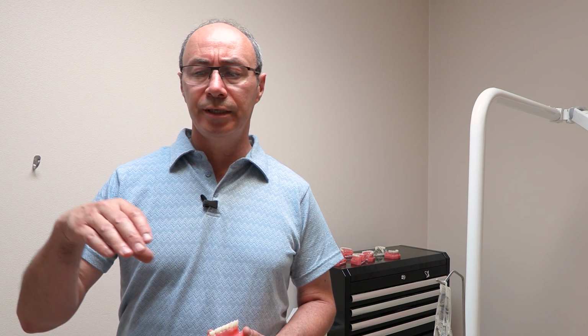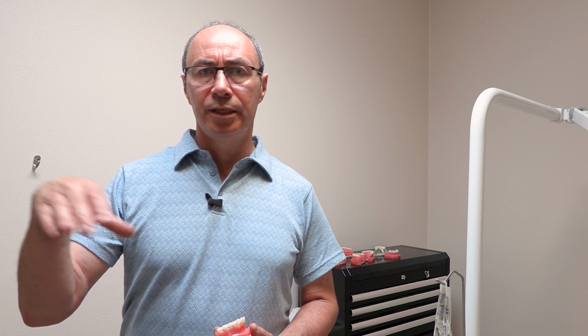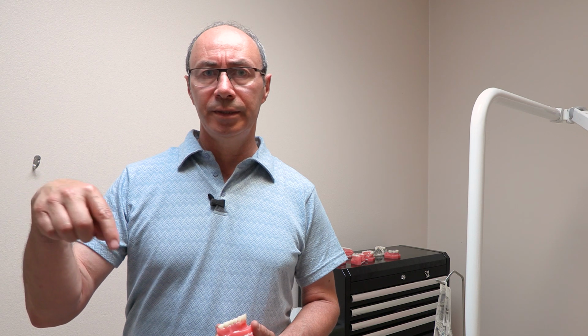A dental bridge: if you have natural teeth and you're missing one tooth, we create a bridge. The bridge is going to need two supports. The molar in the back is going to be reduced in size to be able to place a crown. The tooth in the front is reduced in size to place another crown, and the missing tooth is going to be fused to the other two crowns. That's a conventional bridge.